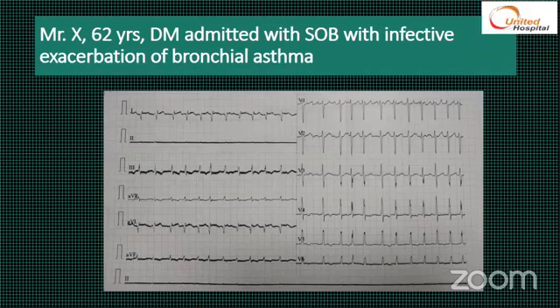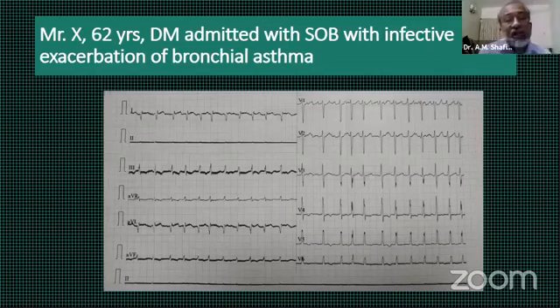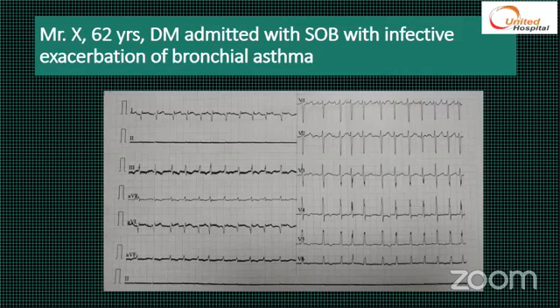Okay. Sir, in this ECG, I can see there is a tachycardia, and the QRS complexes are irregularly irregular. And I think there is T inversion in leads V4, V5, V6. And there is also T inversion in lead 3 and aVF. So far, this is my impression about this. If I want to help you, there are two parts. One is limb leads, another chest leads. So your impression is atrial fibrillation, right? Sir, right, sir. Okay, fine.